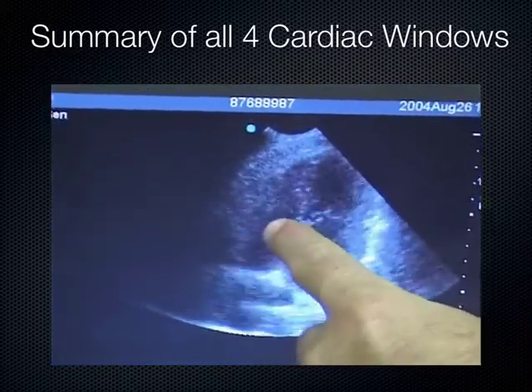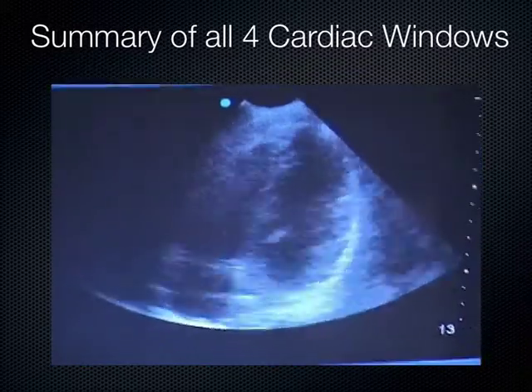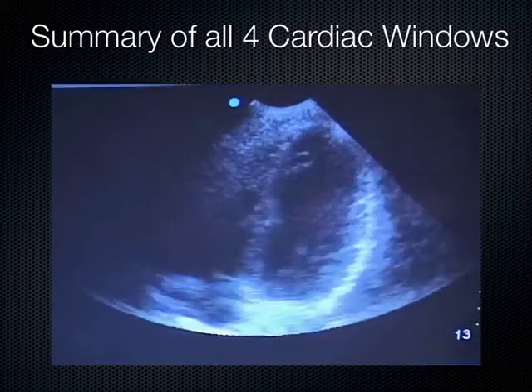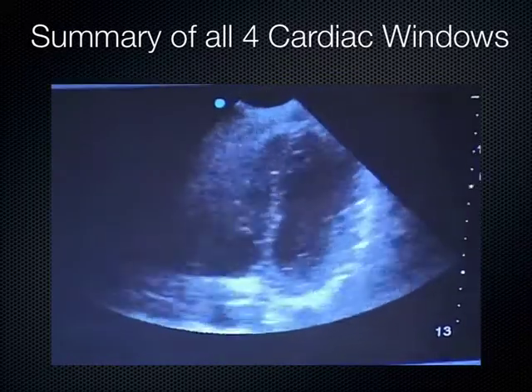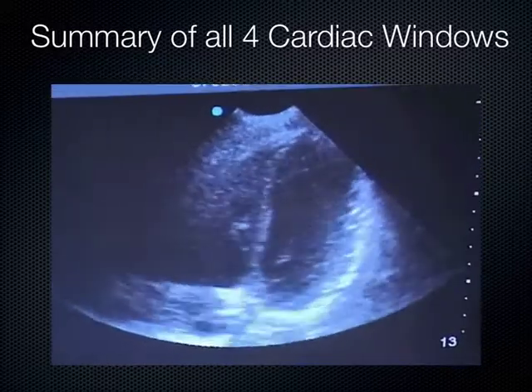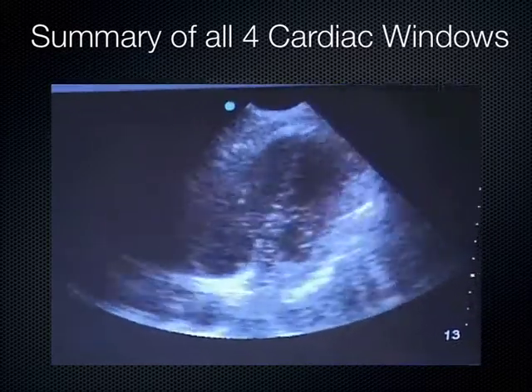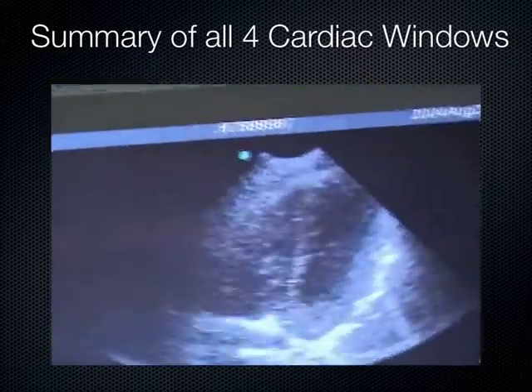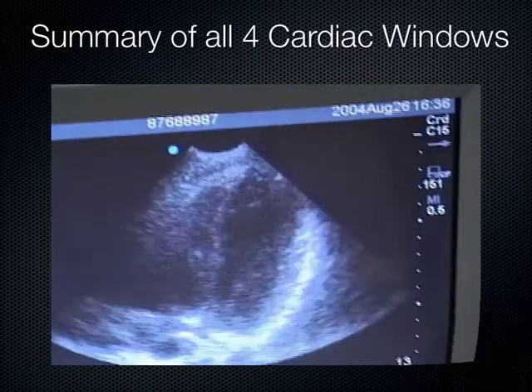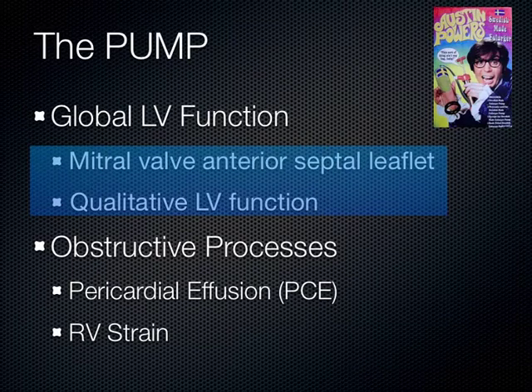When that right ventricle gets really big and approaches the size or even bigger than the left ventricle on an apical view, that's considered right ventricular strain and is suspicious in the right setting for pulmonary embolism. So that's why this apical view can be very helpful. This is the pericardium around the outside of the right and left ventricles. You can look for effusions this way. Okay, so now that you've seen some normal stuff, let's talk about what type of dysfunction we can see.